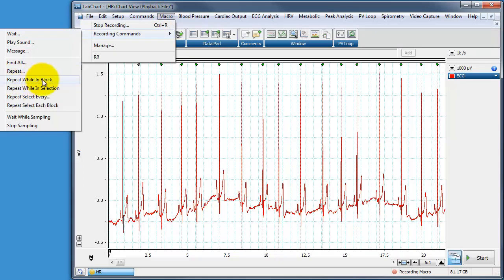So essentially whatever I do after clicking this menu button and when I finished it, it'll repeat whatever was between the first click and the last click as a loop until it reaches the end of the block. And we'll see how that works in a second. So repeat while in block.